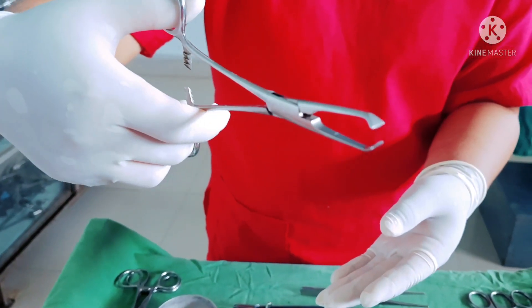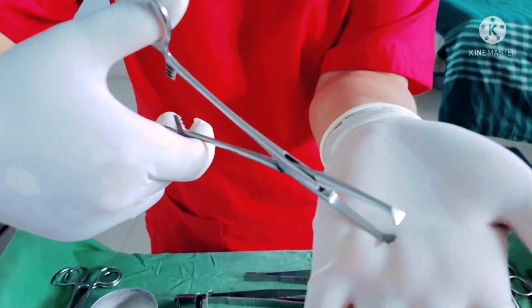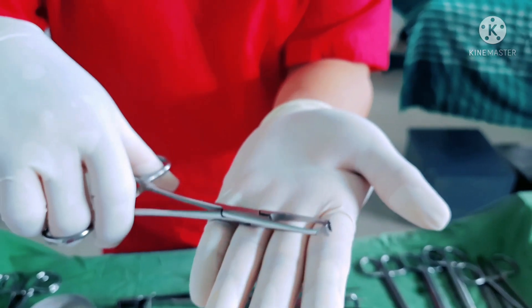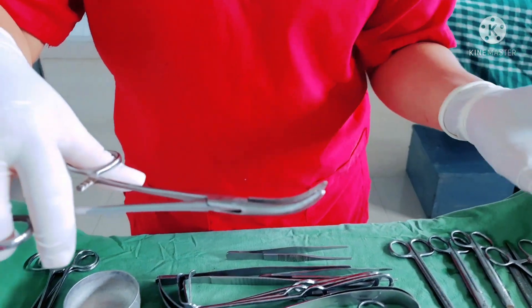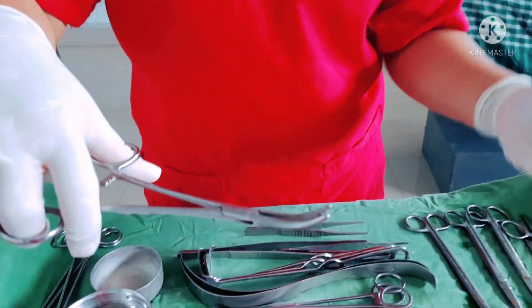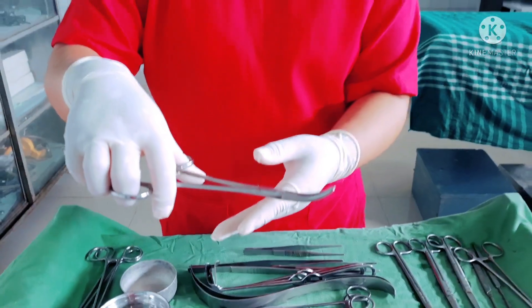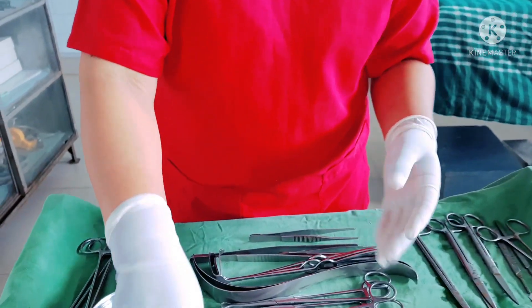This is Alice tissue forceps — a surgical instrument with sharp teeth used to hold or grab heavy tissues. This is curved artery forceps; the main purpose is to control bleeding. Artery forceps are used to grab vessels, arteries, and sutures during surgical procedures.